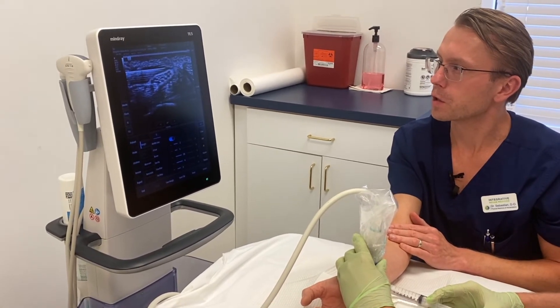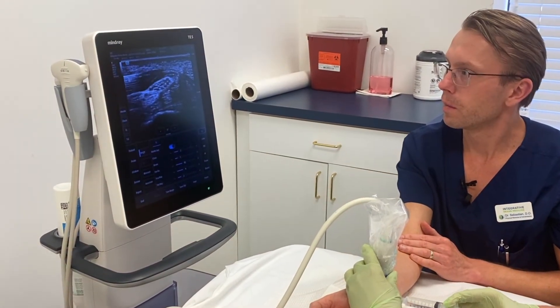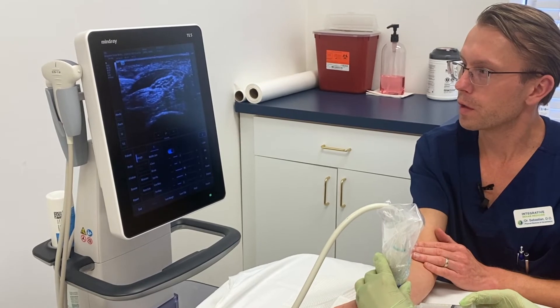The fluid is releasing any scar tissue that may have developed — that's the hydro dissection of the nerve above the nerve. Now Floyd is going to redirect the needle and approach from underneath where the nerve is.